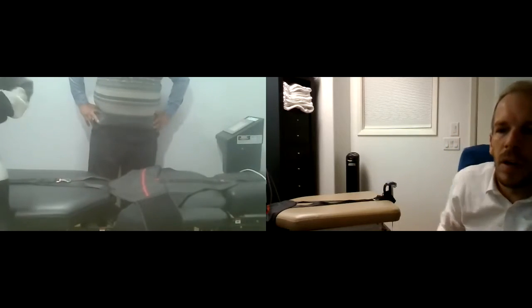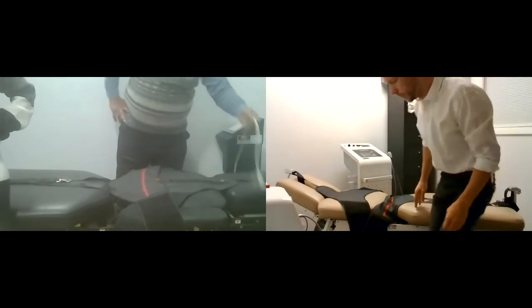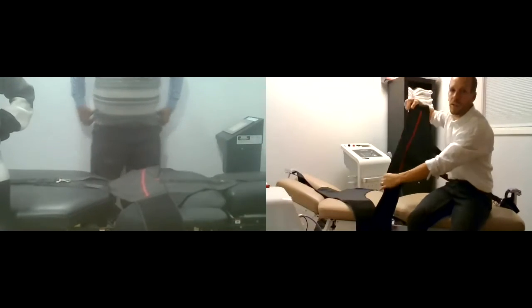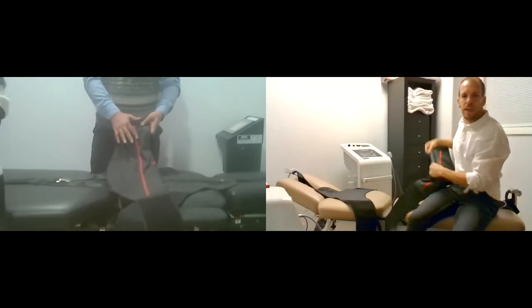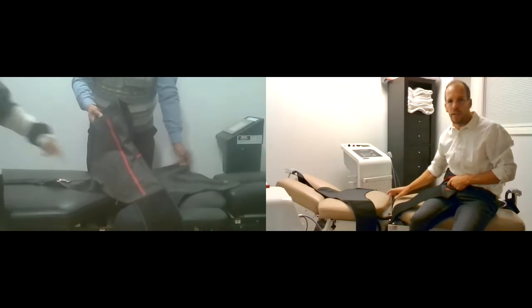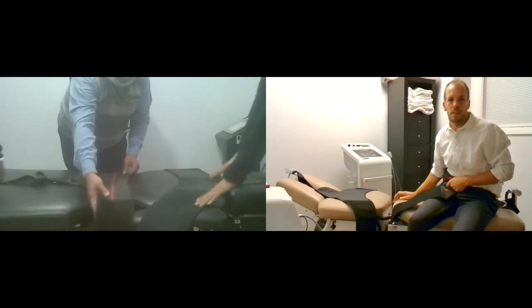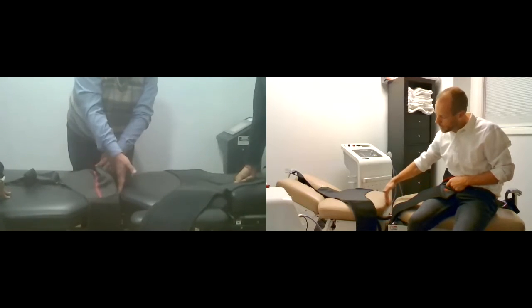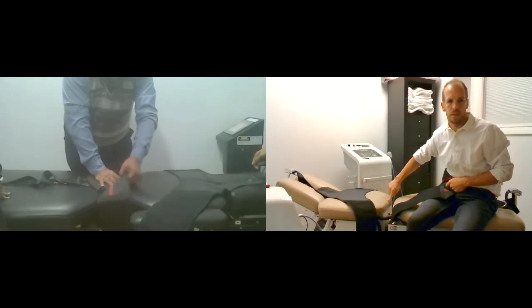So what we're looking for on the harnessing: on your harnessing, you have this red line here. That red line is always going to go in line with the bottom of this cushion right here. So you have this gap in the table. You want the red line to be at the top of the gap, where the bottom of the thoracic cushion is.